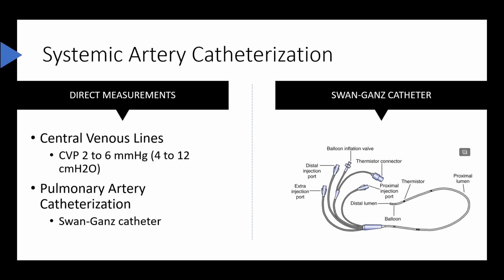Fever in any patient with an intravascular line should alert the clinician to infectious complications. The catheter is removed if there is evidence of local infection or the presence of distal ischemia. Difficulty withdrawing blood or persistence of a damped tracing should also alert the clinician to possible complications, such as the presence of air bubbles in the line or occlusion of the catheterized artery.